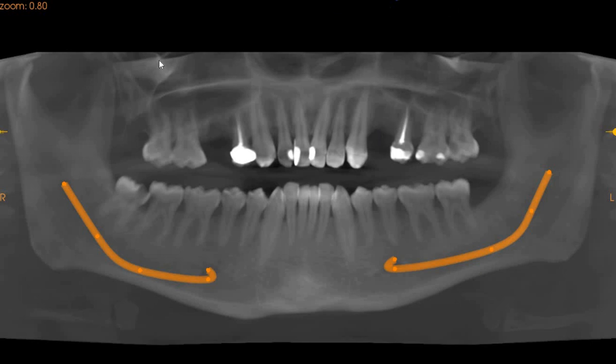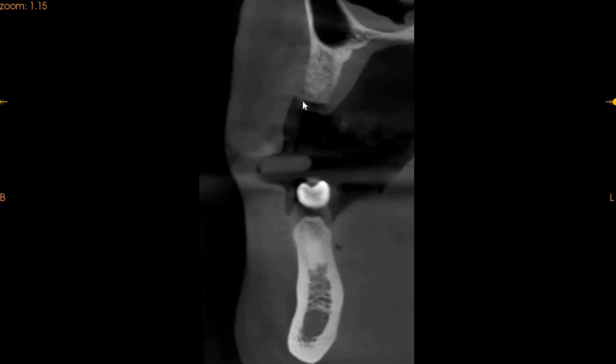Now, taking you to the implant placement, we are going to first measure the ridge on the left-hand side. On the left-hand side, we've got approximately 5.5 mm of ridge width with 12 millimeters of ridge height. The bone quality in this region is D3 because we don't have a very thick cortical plate, but this seems to be very good grafted bone, and we don't see any problems with implant placement in this region.